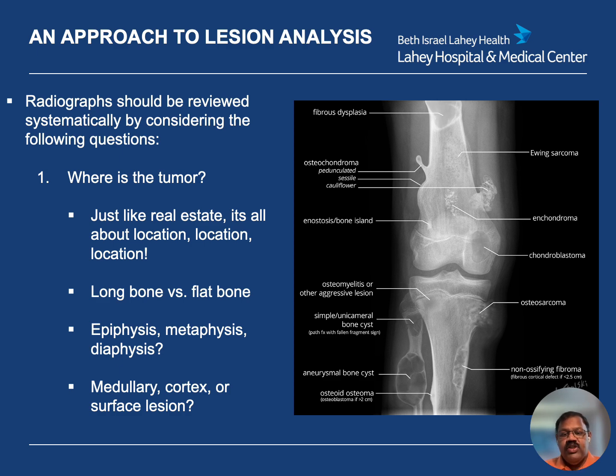So look and understand what type of bone it is. Is it a long bone or is it a flat bone? Is the lesion specifically located in the epiphysis?